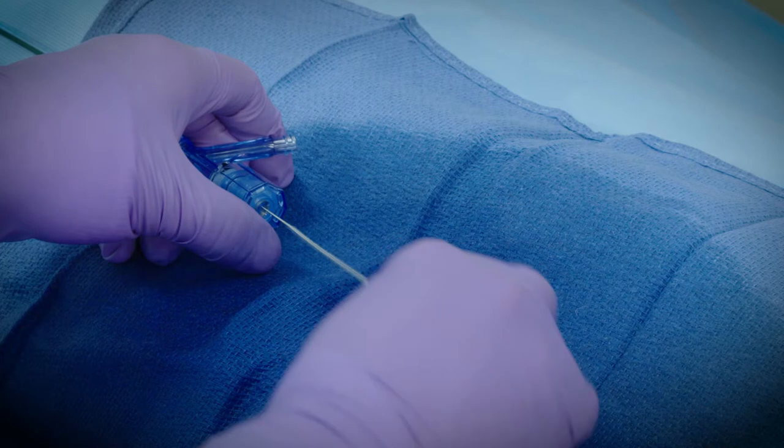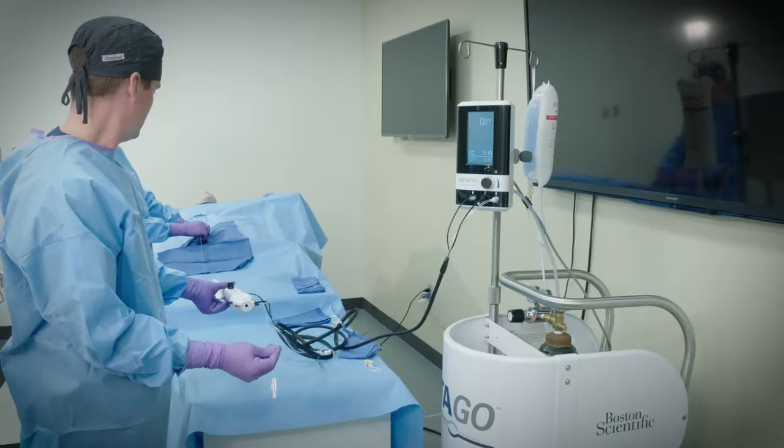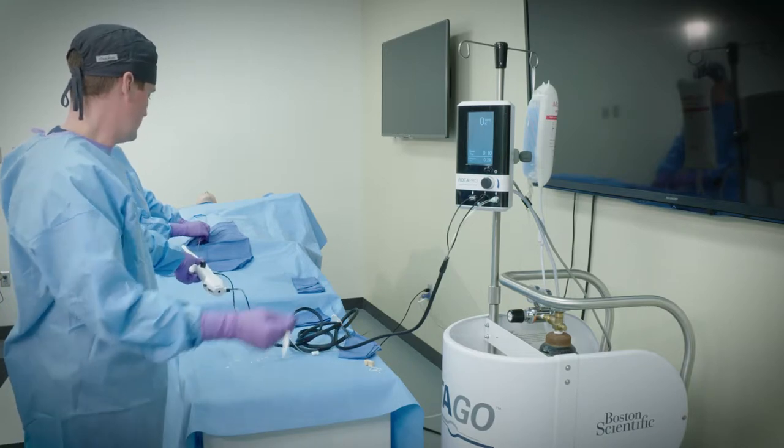Introduce the catheter through the hemostasis valve. Under fluoroscopic guidance, gently push the burr through the guiding catheter to a point immediately proximal to the lesion.